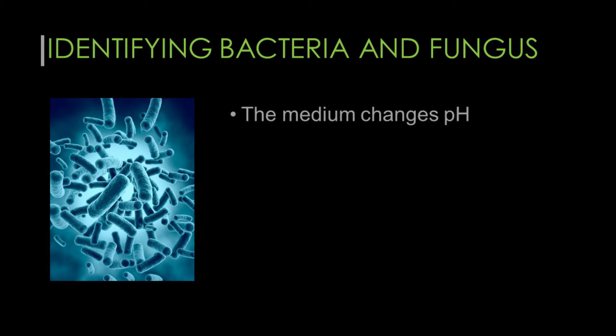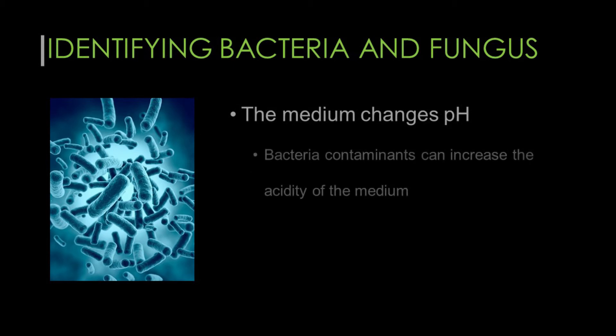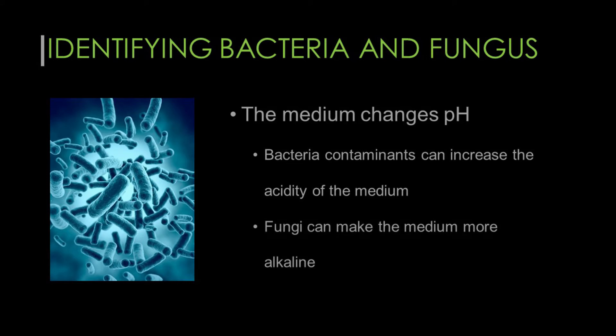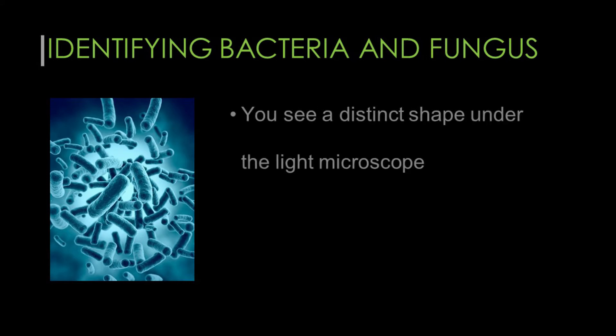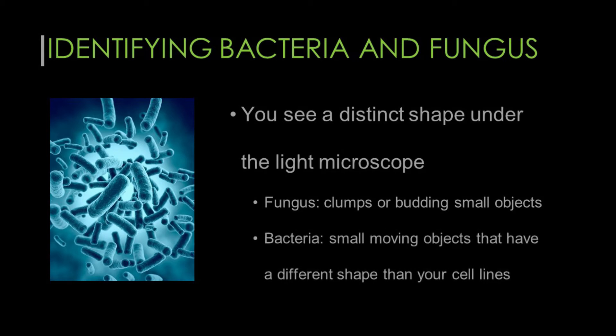The medium also changes pH. Bacterial contaminants can increase the acidity of the medium, whereas fungi might make the medium more alkaline. You can also see a distinct shape under the light microscope. With fungal contamination, there might be clumps or small budding objects, whereas with bacterial contamination, you're likely to see small moving objects that have a different shape than your cell lines.